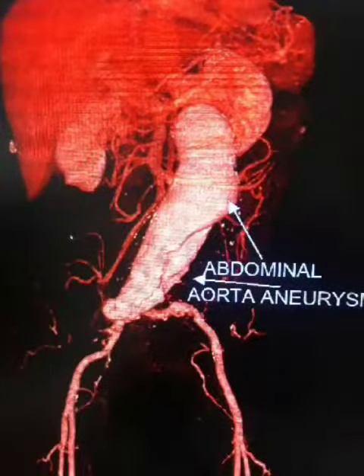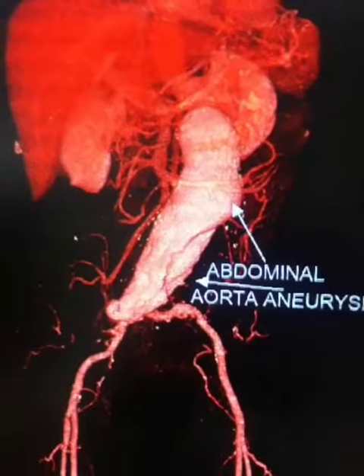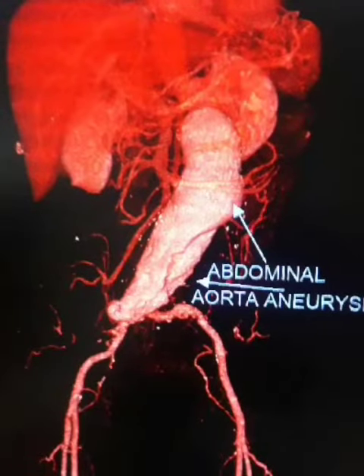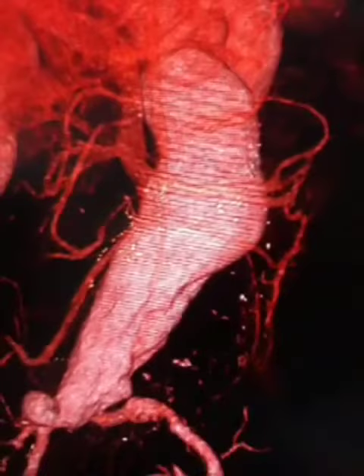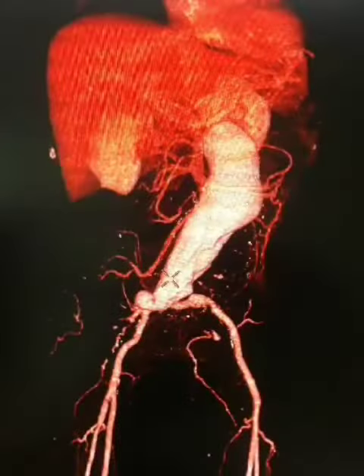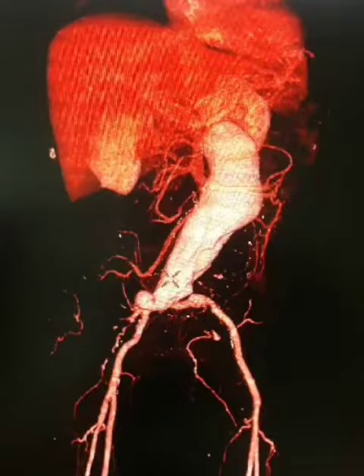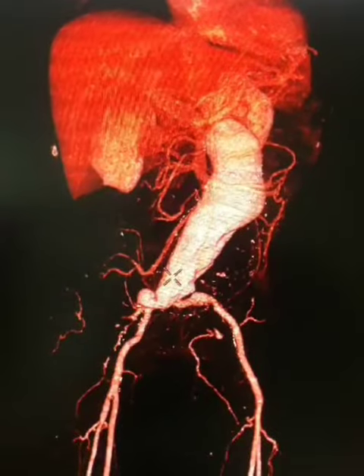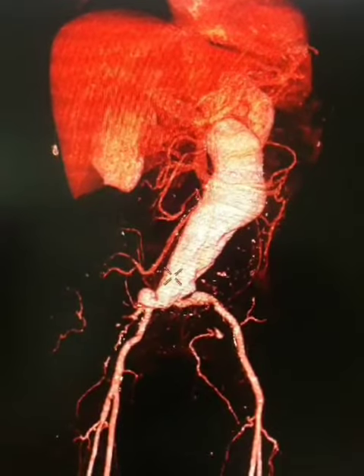Hello viewers, today we are seeing a long segment abdominal aortic aneurysm CT scan 3D image. This is a rare case. It is a very common case.